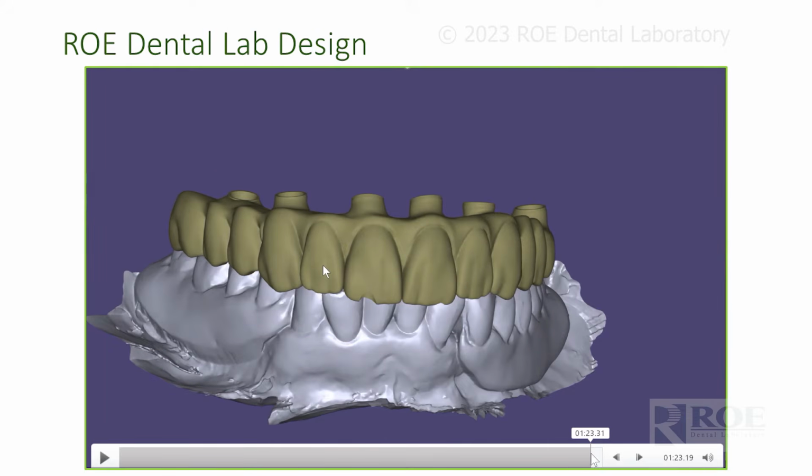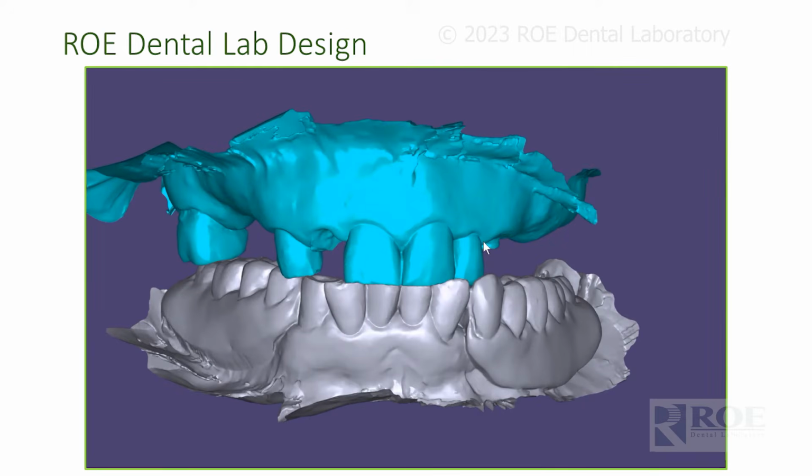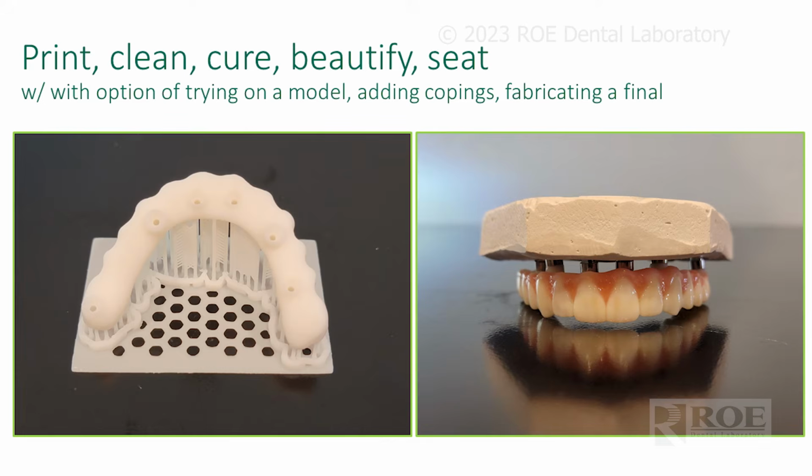I think a lot of offices want to do it same day, but let's face it, by the time an hour goes by, and then nesting, curing, cleaning, beautifying, it's a lot of time in the chair. So you'll have to decide if that's right for you or not. Okay, so here's an in-office print. Looks very nice. Very nice work. And the patient, this was the same day.